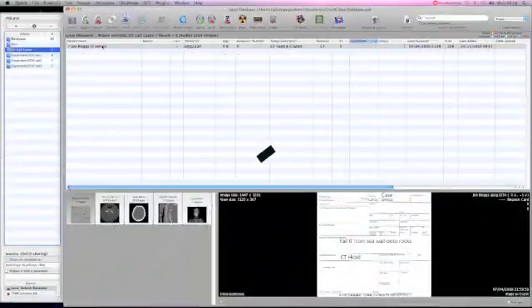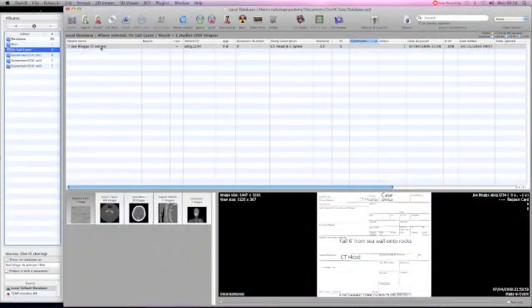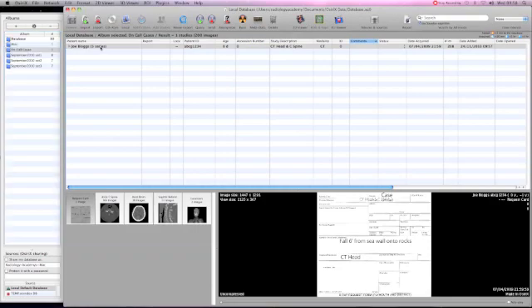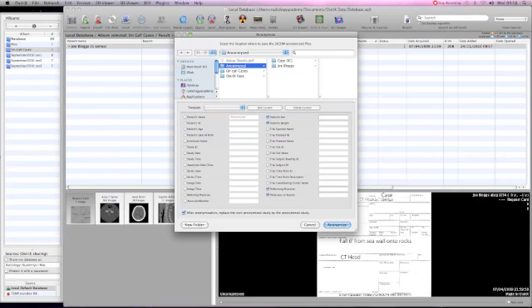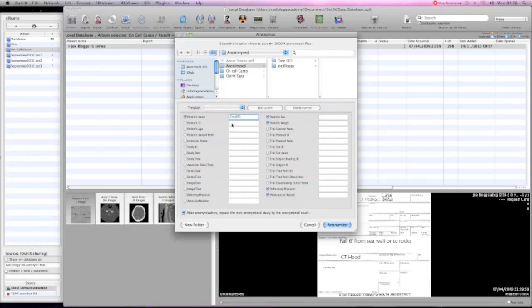There is a quicker way to anonymize a folder. If we click on JoeBlogs and we anonymize, we identify patient name and ID along with all the other parameters we've already described. We identify the case again as case 001, put in another entry under patient ID.